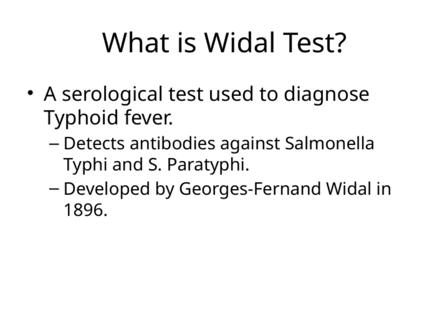So on this slide, we're looking at a serological test used to diagnose typhoid fever. Essentially, this test detects the presence of antibodies in the blood that are produced in response to salmonella typhi and paratyphi infections. These are the bacteria responsible for causing typhoid. The test was developed quite a long time ago, in 1896, by Georges Fernand WIDAL, which is why it's called the WIDAL test.